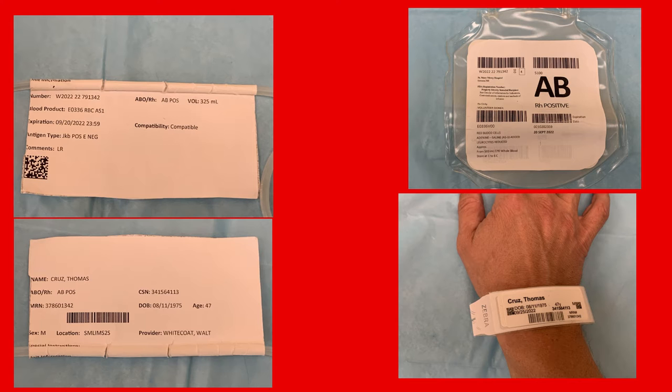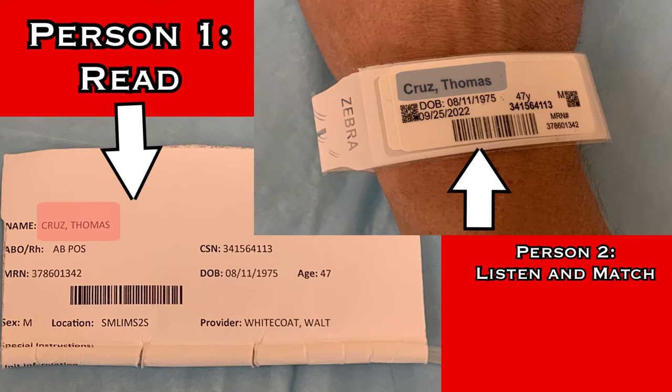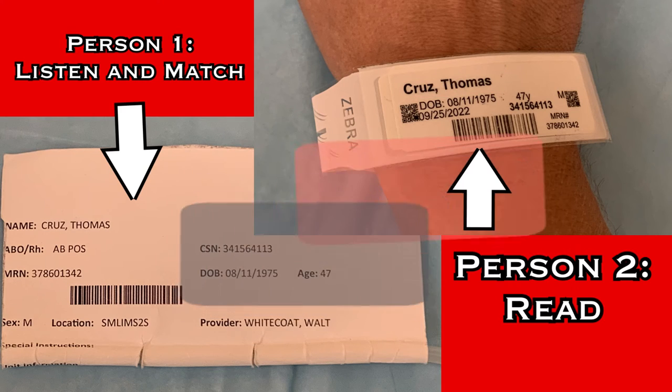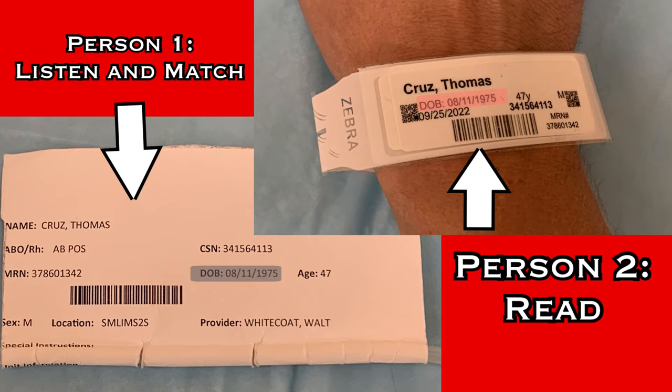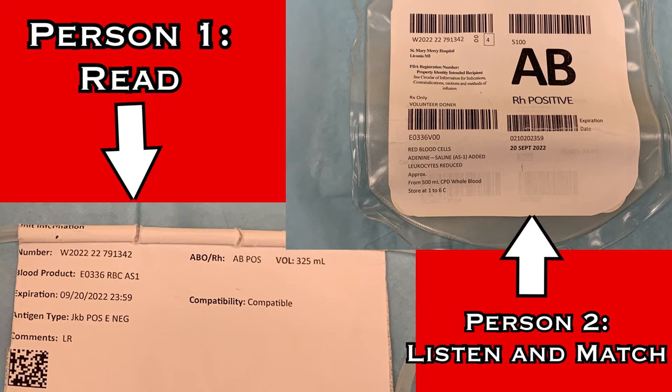Begin by verifying the patient. One person will read from the sticker attached to the blood product while the other listens and matches that to the patient's wristband. Read and spell the patient name, read the birthday, and read the MRN. Then reverse the process and the listener will read off the wristband as the partner matches to the sticker. Once patient identity is confirmed, move on to verify the product by matching information from the bag to the information on the other side of the sticker.